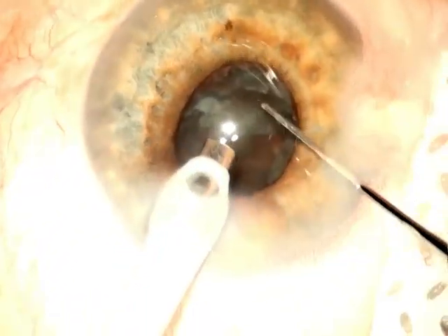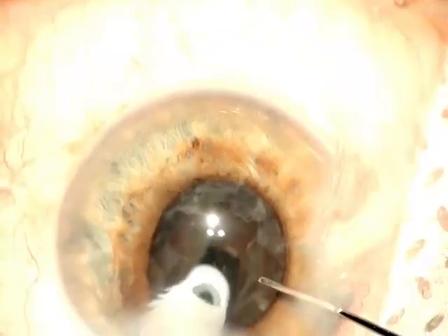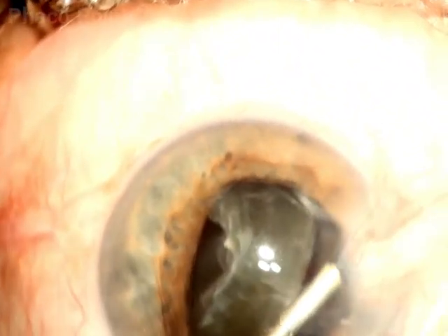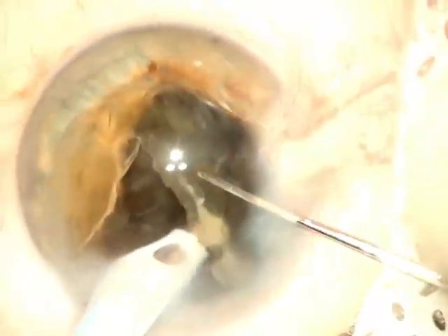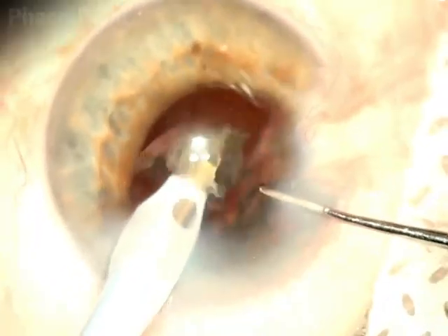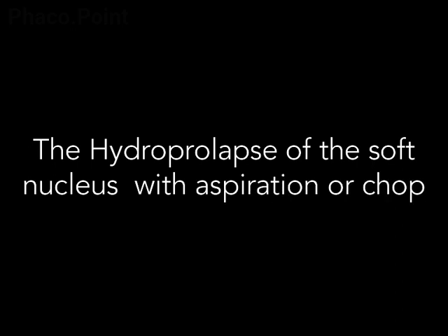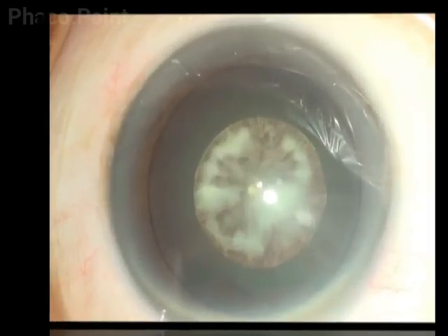The easiest way to deal with an epinuclear bowl if you're unable to get it out is to come out of the eye — do not put in any viscoelastic — but with care and caution perform a hydroprolapse of one pole of this epinuclear bowl, which allows for ease in its subsequent emulsification. Having clearly understood the limitations of sculpt, divide and conquer, stop and chop, or direct chop for soft cataracts, the simplest, surest, easiest to perform, easiest to learn, safest, and most reproducible technique is the hydroprolapse and aspiration or hydroprolapse and chop.